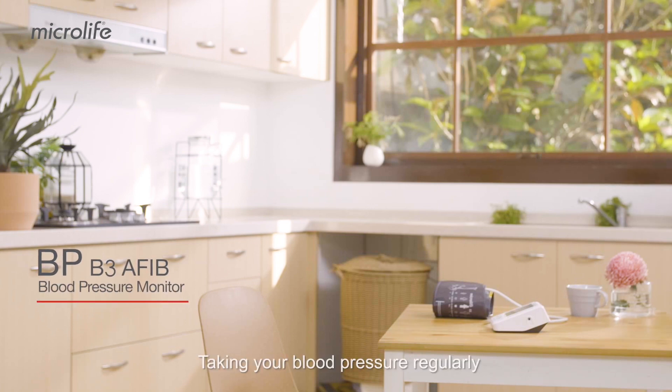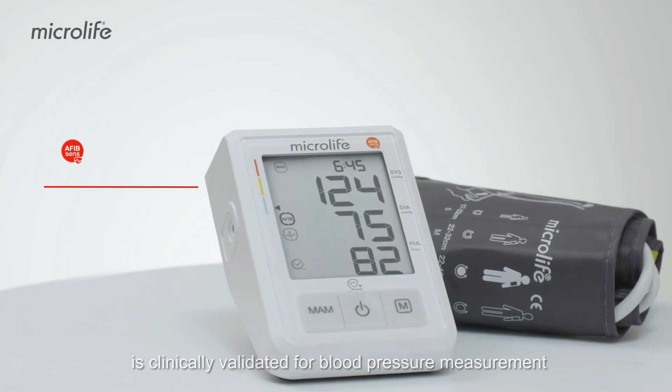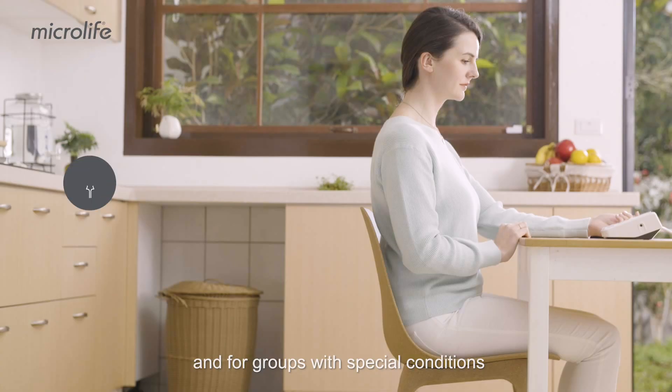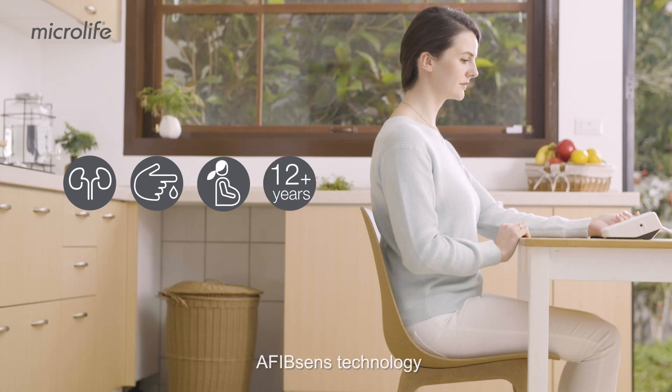Taking your blood pressure regularly can help get your blood pressure under control. Microlife B3 AFib is clinically validated for blood pressure measurement in the general population and for groups with special conditions, and can detect atrial fibrillation with Microlife's clinically proven AFibSense technology.